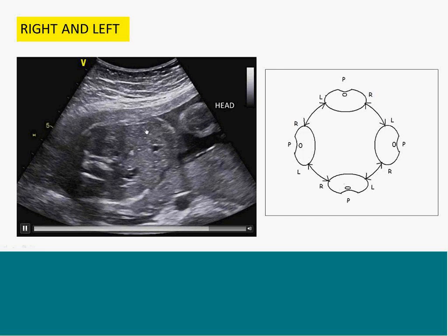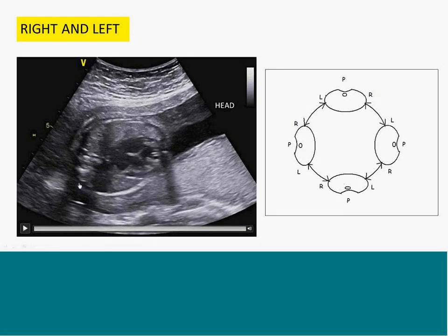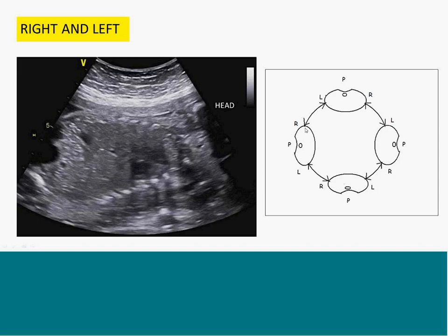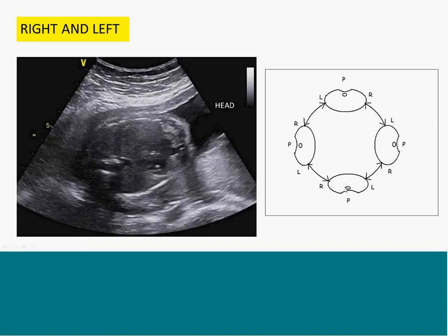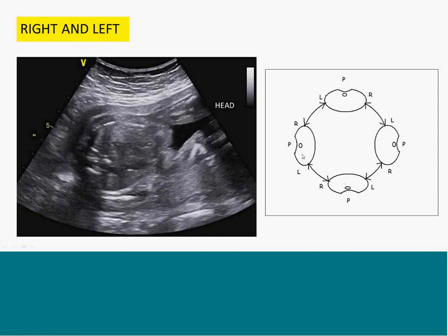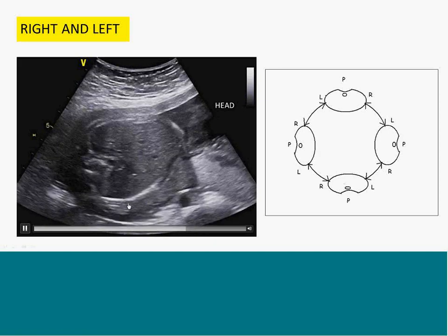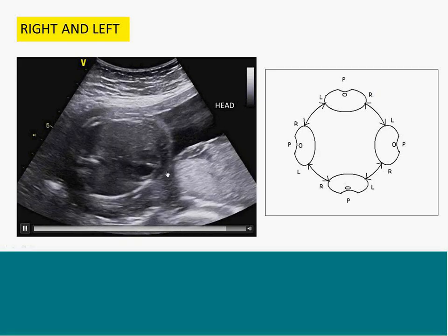The actual section of the baby's chest, you can sweep from the abdomen a little and come to the thoracic cavity. When you go into the thoracic cavity, you will get a cut section like this. It could be in any of the 4 possible positions. So, for example, in this section, this is the spine and this is the sternum.